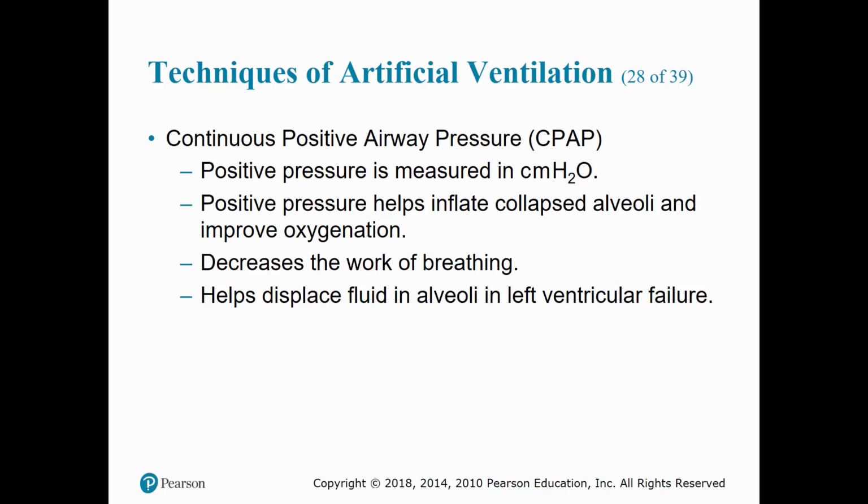Left ventricular failure increases hydrostatic pressure inside the pulmonary capillaries, thus forcing fluid out of the capillaries and into the adjoining alveoli, displacing the air in the alveoli and inhibiting gas exchange. The continuous pressure created in the alveoli by CPAP prevents further fluid leakage into the alveoli and forces fluid that may already have accumulated out of the alveoli and back into the interstitial space in the capillaries. CPAP improves the heart rate and blood pressure and reduces the sympathetic tone by improving gas exchange and oxygenation.